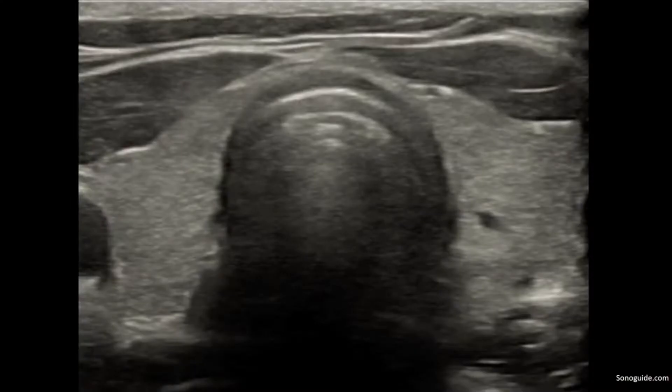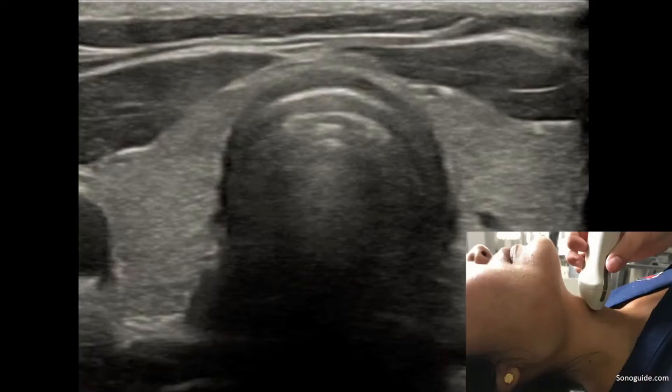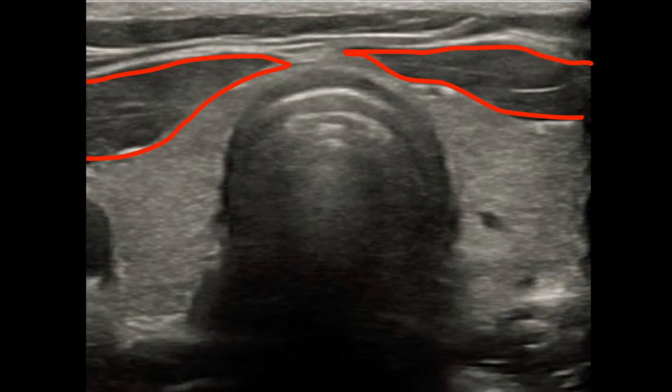So this is a view that you want to get. It's pretty easy to get, even on a patient with a large thick neck or some distorted anatomy. You use the linear probe; you just place it in transverse orientation. You can also get a longitudinal view as well. The trachea is going to be front and center. It's not a difficult technique to learn, and this is why I think this can be helpful for any emergency physician, whether you are ultrasound trained, super ultrasound savvy or not. In the near field, you're going to see some of that soft tissue. When this becomes thickened or edematous from some sort of pathology, this is going to be more prominent, so make sure you pay attention to the neck thickness.